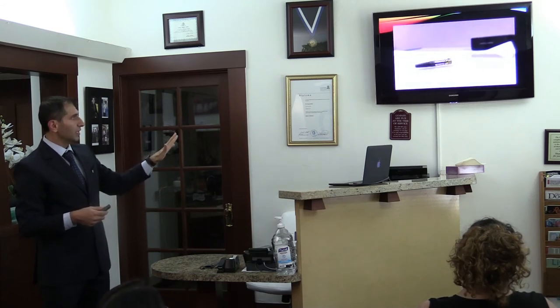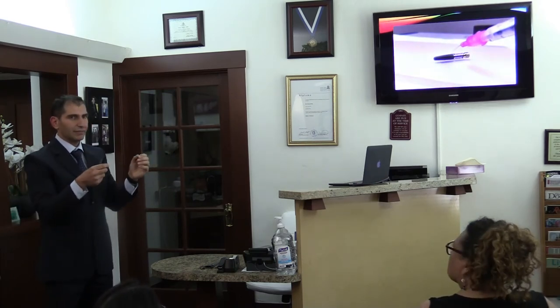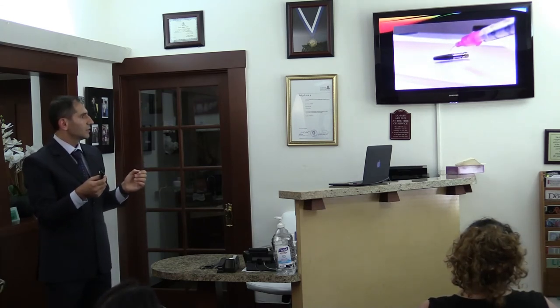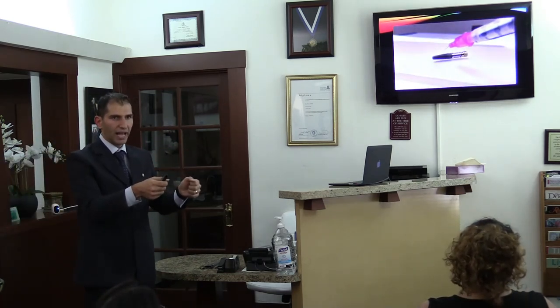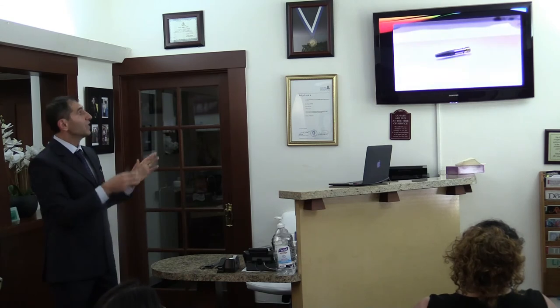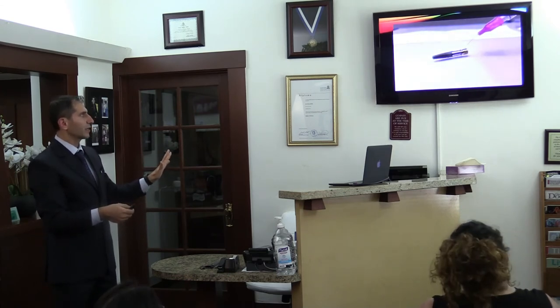The abutment surface and the implant surface, this is hydrophilic. I'm sorry, hydrophobic. And you can see when it's hydrophobic, it's like, don't want to mix. It's hating the water. You see that drop? Now think about that drop of water as a cell. Does the cell want to touch the implant? Want to interact? Want to have an interface with it? No. Now we change the surface chemistry and energy. Now this surface is super hydrophilic.